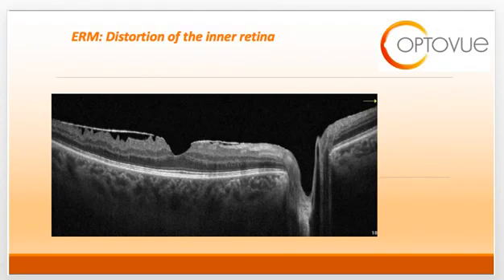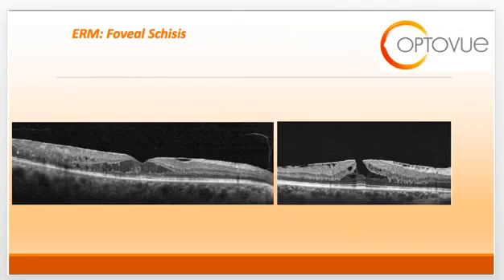The outer nuclear layer, outer plexiform layer, inner nuclear, and inner plexiform layers are all distorted due to that tractional force. Another complication of ERM is foveal schesis — separation of the inner and outer retinal tissues by column-like lesions visible as vertical lines on the OCT scan. The one on the left-hand side does not have a hole. The one on the right-hand side shows the development of a lamellar macular hole or partial thickness macular hole, again visualized by that anvil-shaped lesion.